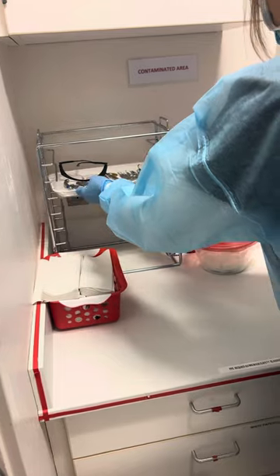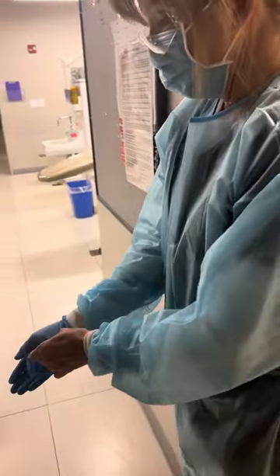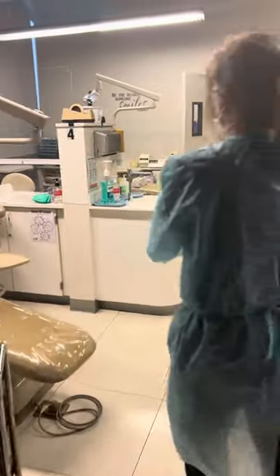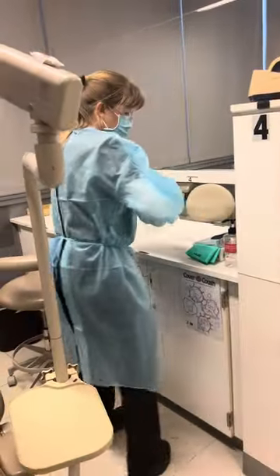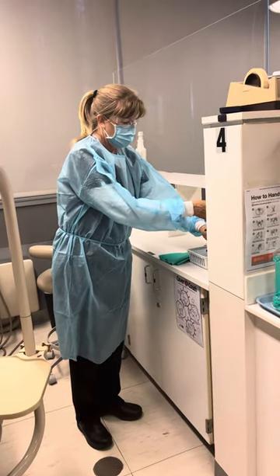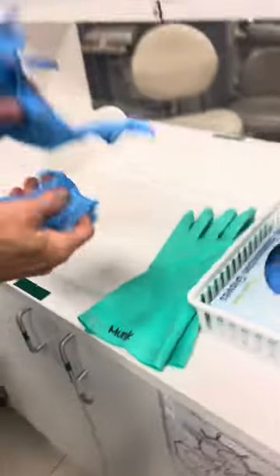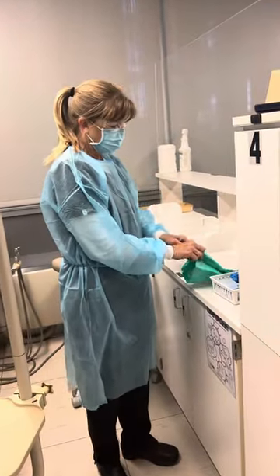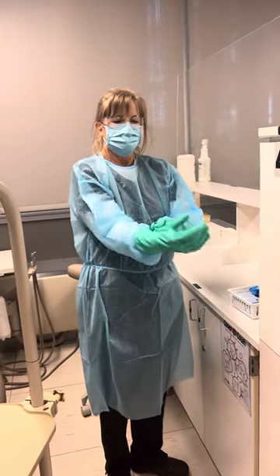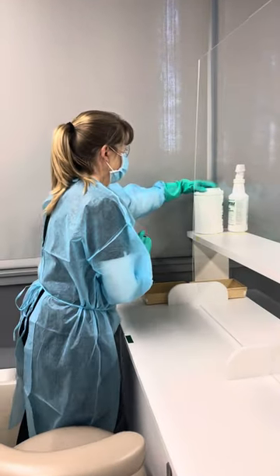Immediately she's removing her gloves — you don't want to walk in the hallway with dirty gloves on. Into the trash, then hand hygiene, and now we're going back to disinfect the room. She needs to put on her exam gloves and utility gloves. If the utility gloves are your own, you can choose to wear gloves underneath or not. Now we're disinfecting only where there were no barriers, because our barriers were not broken when we took them off.